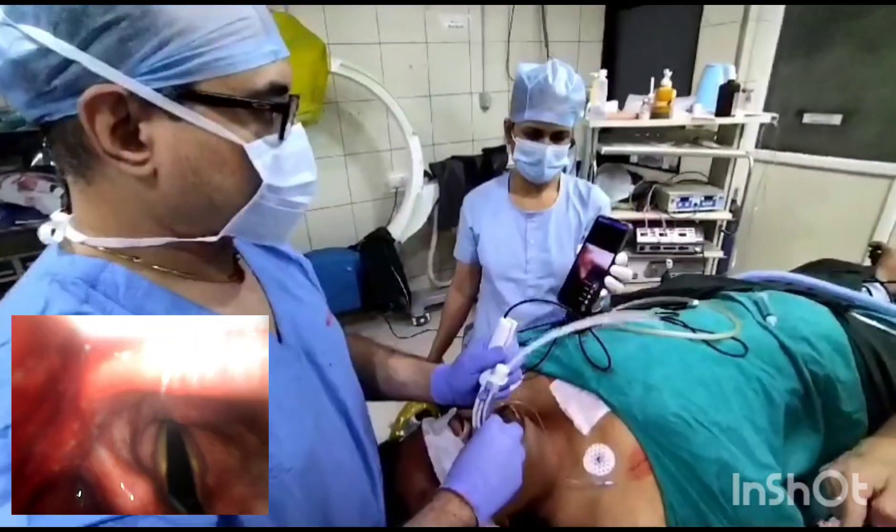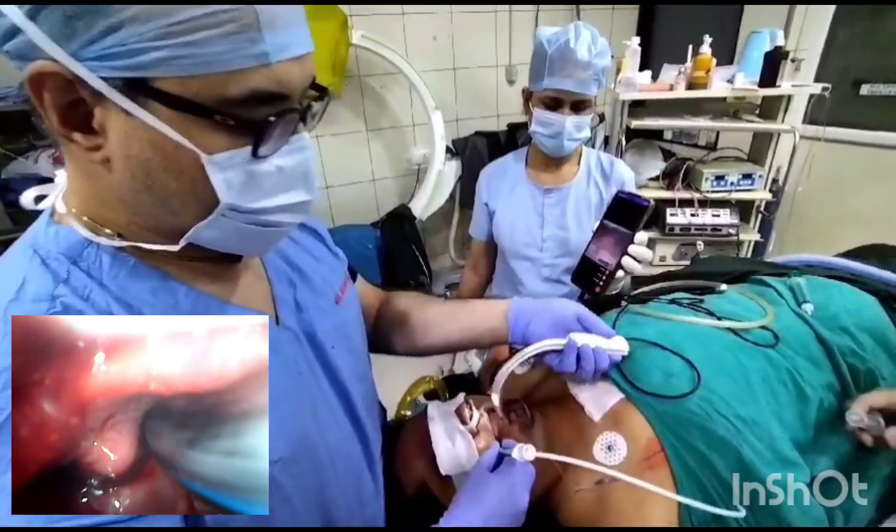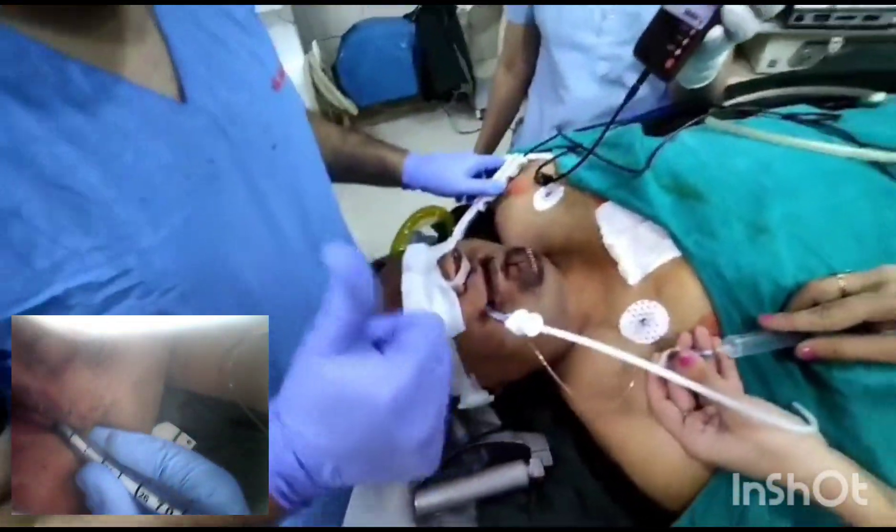See the tube entering into the larynx — intubation is done. Taking the TAscope out. You can see the oral bleed which has been there inside. Intubation is done.